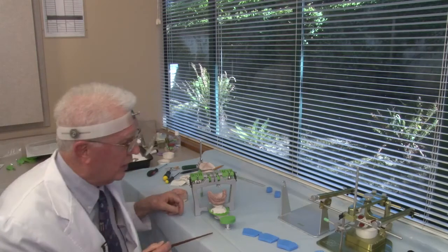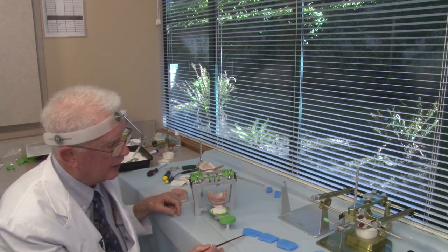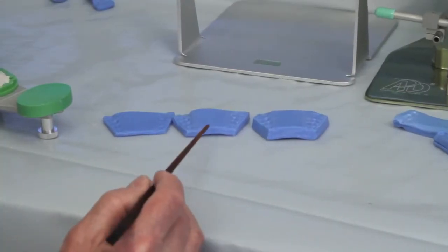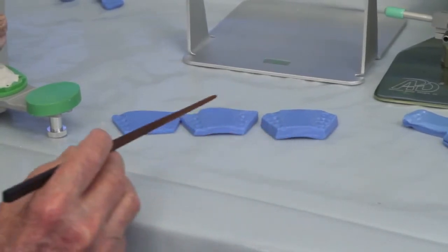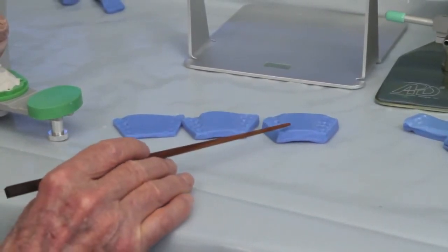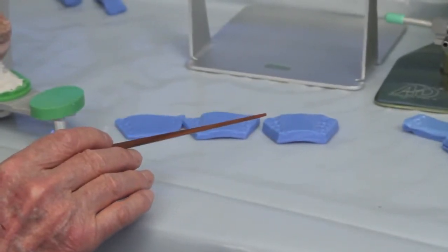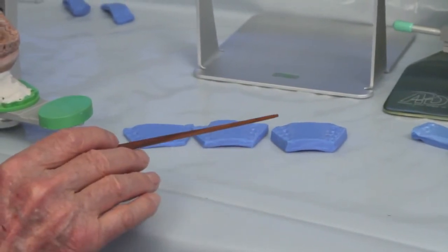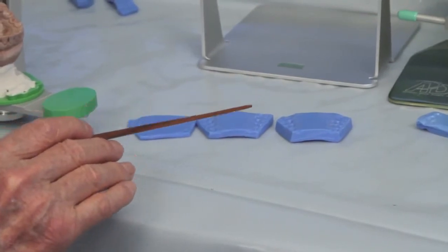Okay, if you remember when I did the wax bites, I did a series of posterior wax bites with varying thicknesses. This was one thickness of wax, this was two thicknesses, and this was three thicknesses of wax. In other words, in the thicker piece of wax here, the mandible is farther open. The second, two layers, the mandible is closed some. And in the thin layer, the mandible is closed even more.